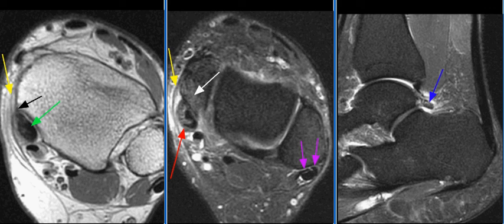MR findings are consistent with severe tendinosis of the tibialis posterior tendon with high-grade type 1 partial tear, and moderate peroneus brevis tendinosis with a longitudinal split.